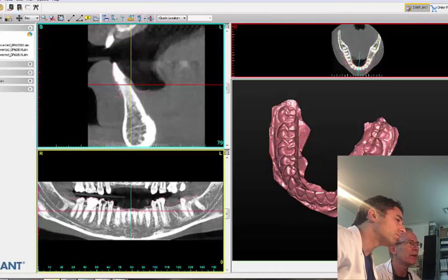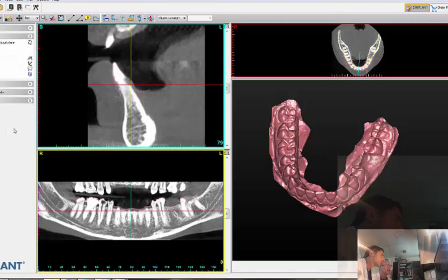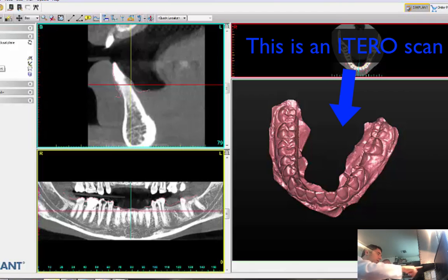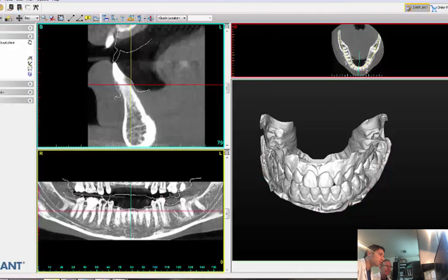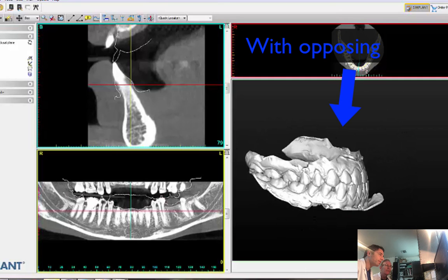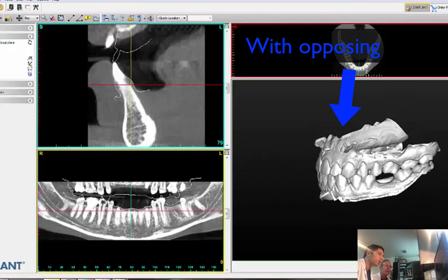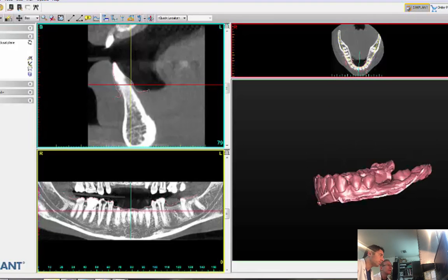This is where you start off. The DICOM images are in — this is an iTero scan. You can see the iTero scan has an opposing. She's like a Class 3. So you don't have a wax-up. Can we do a virtual wax-up? Sure — we'll do a virtual because it's only one tooth. But let's map the nerve first.